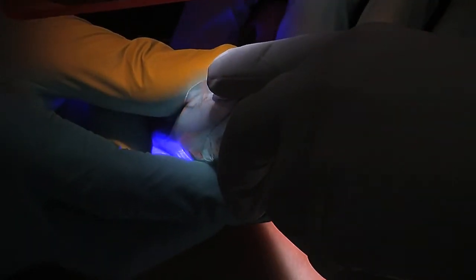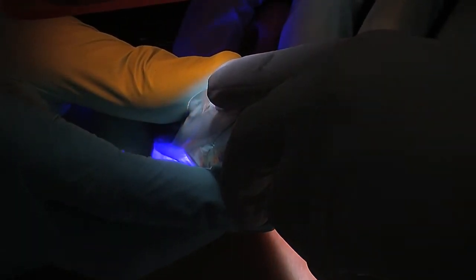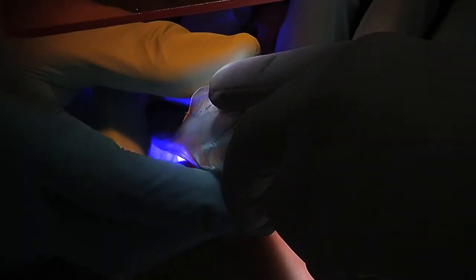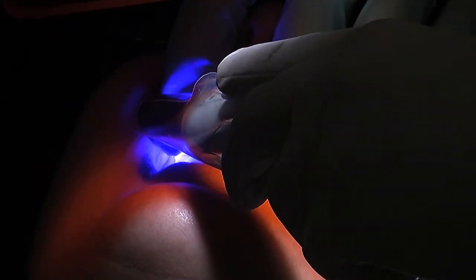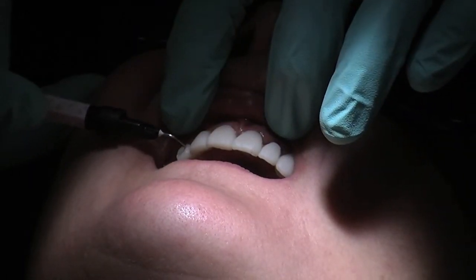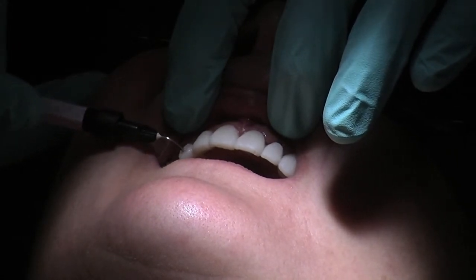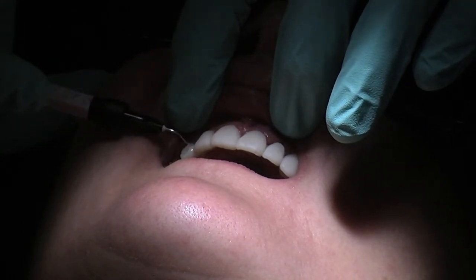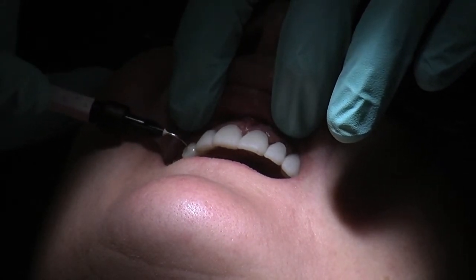So the other great thing about Luxaflow is you can make shape changes. You can add to the buccal fullness, apart from just filling in the voids and things that need attention, they're obvious. And this will obviously help improve the trial smile for the patient and yourself to diagnose. That's fine, take it out. Then I'm just going to add a little bit here like this, like a flowing movement. I'm actually just bringing out the whole of the labial contour. You can change line angles, you can make teeth look wider, you can make them look narrower. It's all very quick and easy to do.